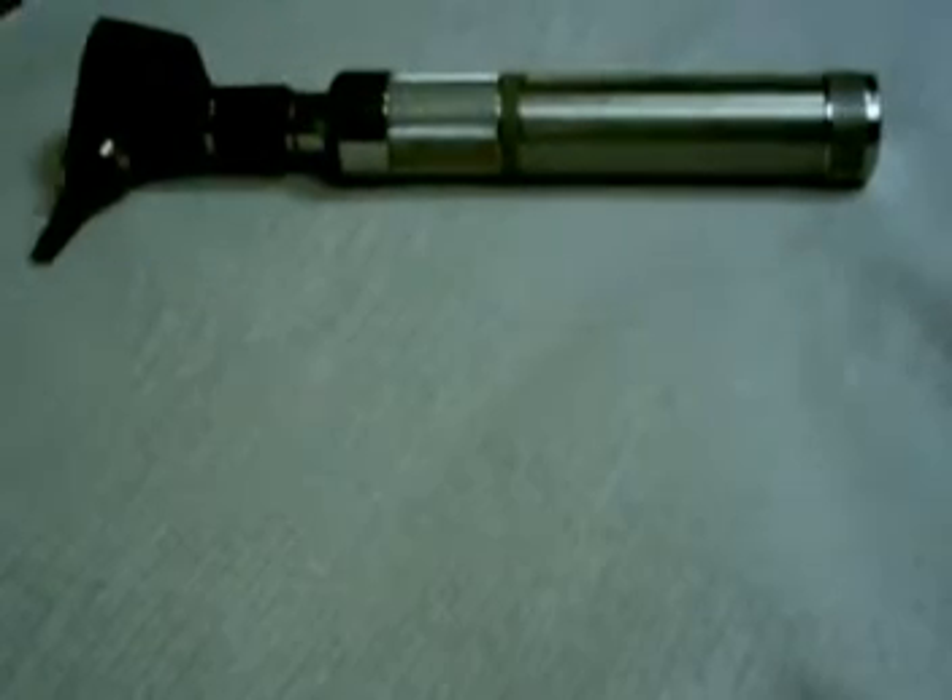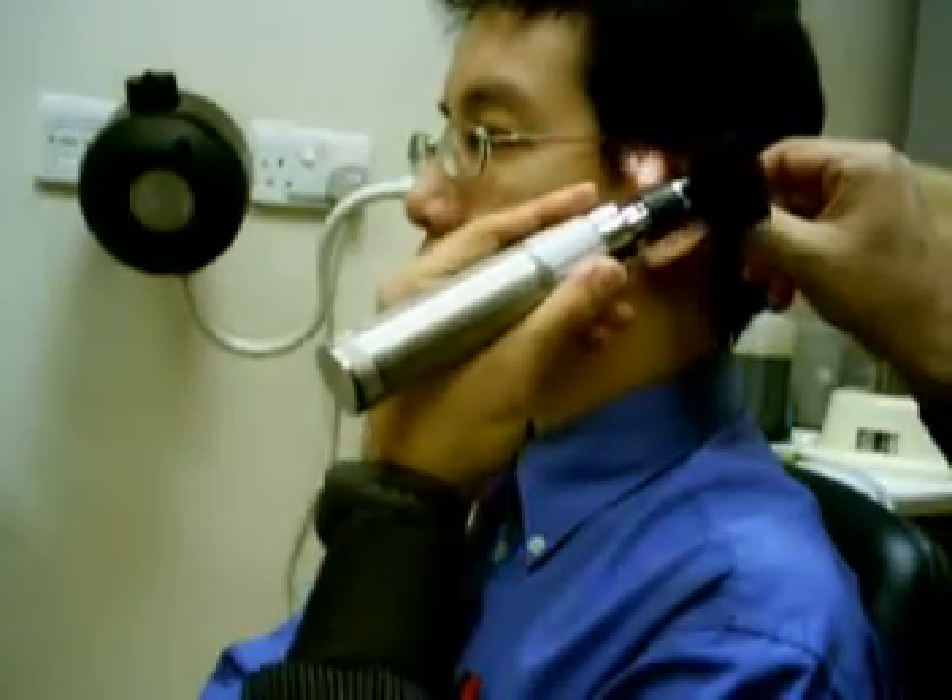You will need an otoscope and a speculum, easily fitted on. Ensure the patient is sat upright, 90 degrees away from you.